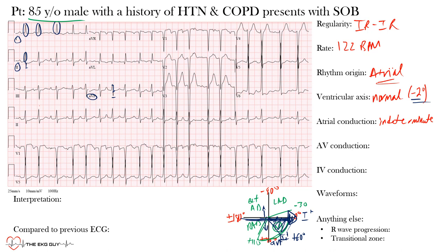For AV conduction, the normal PR interval in adults is 120 to 200 milliseconds, or three to five small boxes. The PR interval varies here because we have multiple ectopic atrial foci each firing differently. However, we have one-to-one atrial-to-ventricular conduction with no dropped beats, so AV conduction is considered normal, even though the PR interval changes with each different atrial focus.